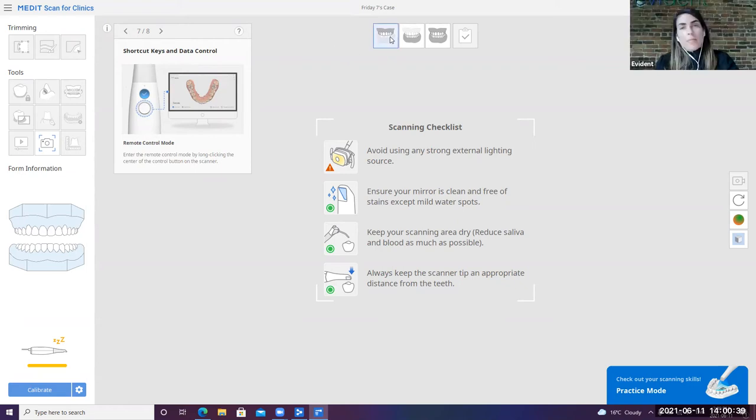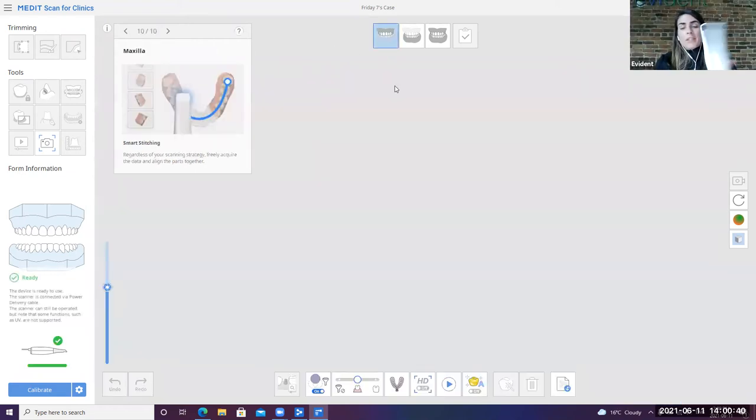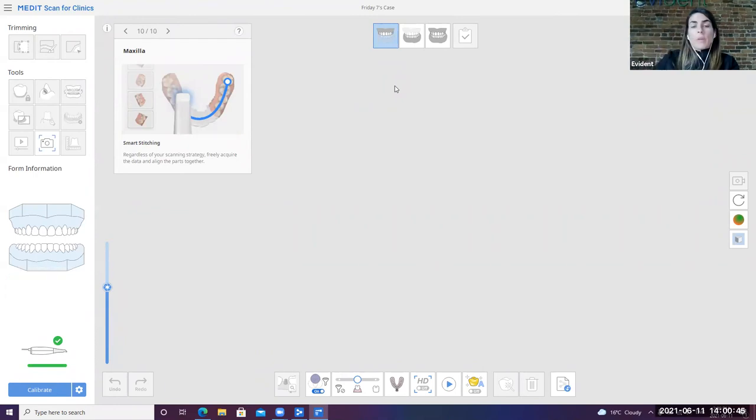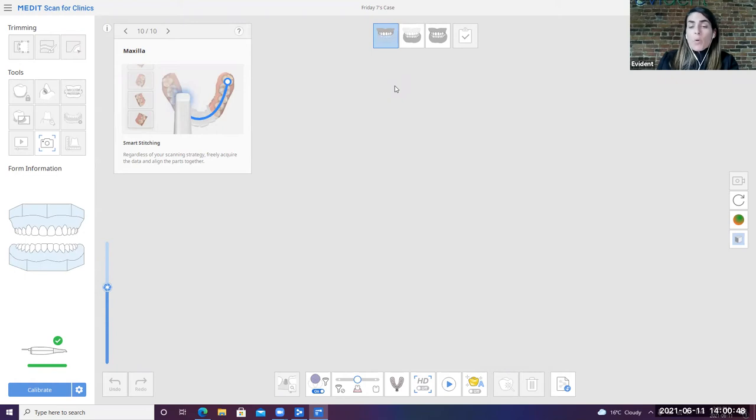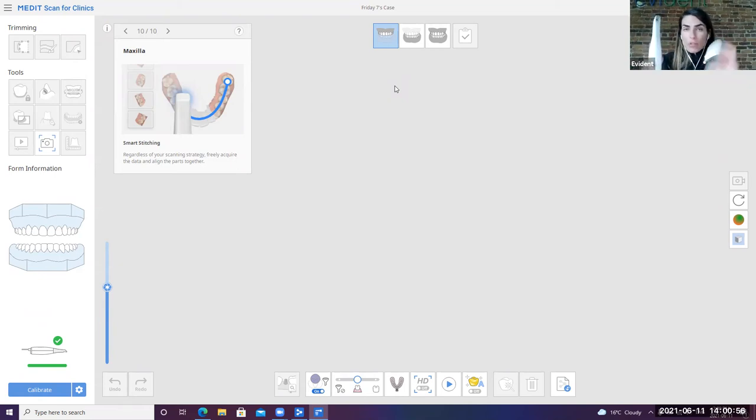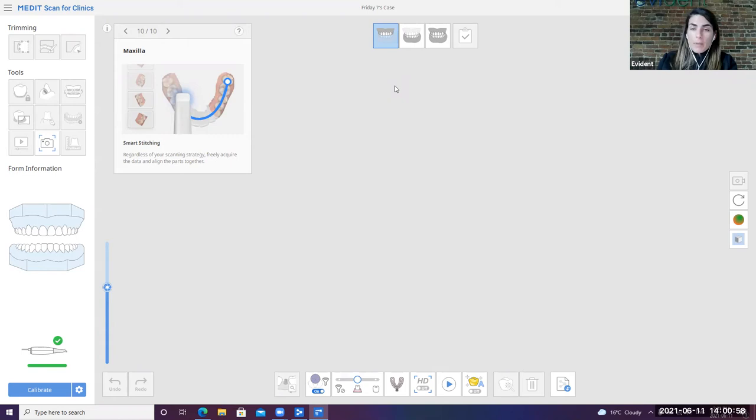So I'm going to go ahead and select the upper. So typically when I scan, I try to do this little rotative motion like this in order to be able to capture what I call the tops of my mountains. The whole point that I'm trying to achieve is ensure that I have occlusal markers in place in order to be able to then continue to build the wall of my so-called mountain. So I'm going to go ahead and start scanning my upper.